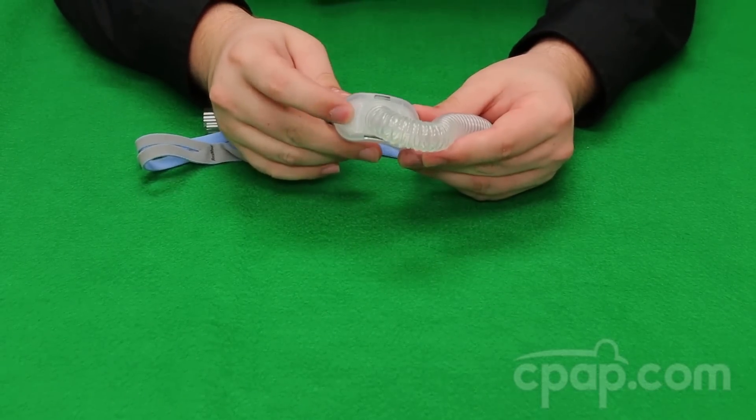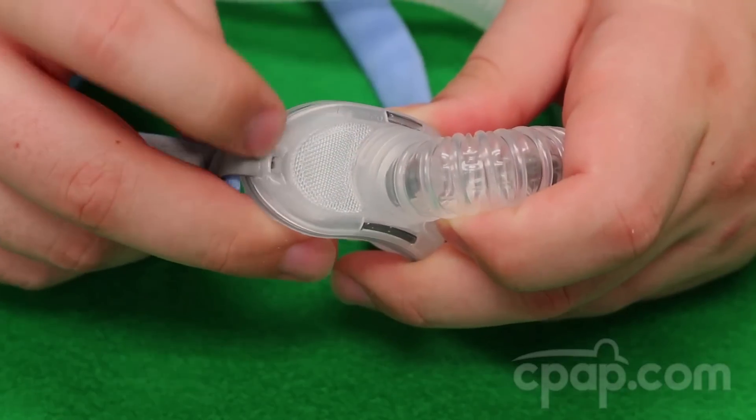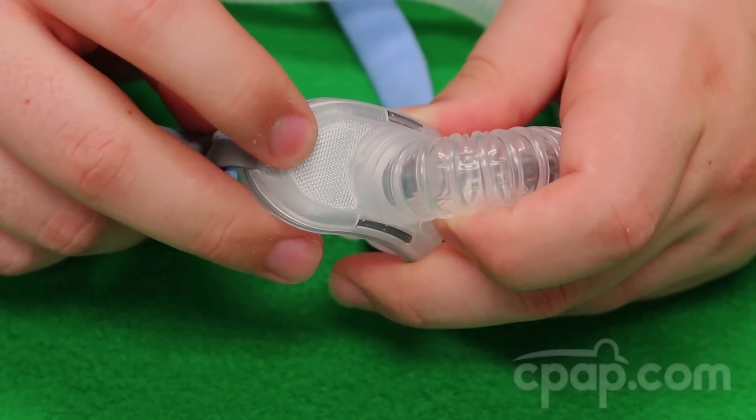The QuietAir woven mesh exhalation vent is what makes this mask so quiet. This woven mesh creates countless ports for the air to escape through, which keeps the air from blowing onto the user or bed partner.